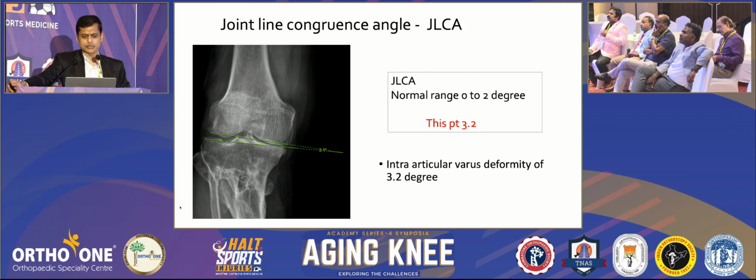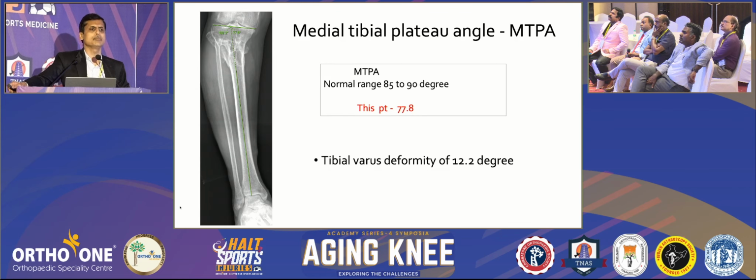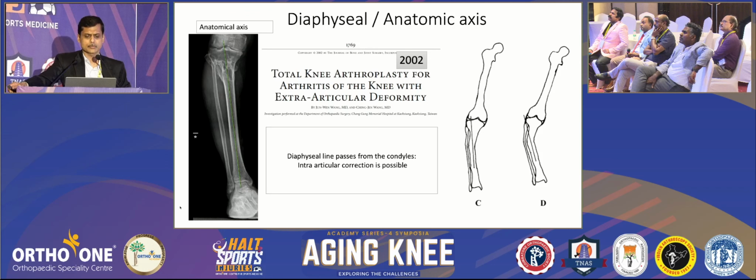All those things have to be considered and kept in mind while doing the surgery. So if you look at all these angles, it is almost within the limit of doing an intraarticular correction. So if you look at this, I actually made it for the youngsters.